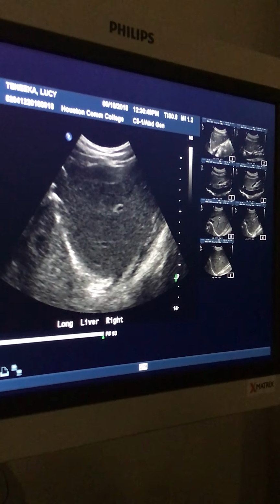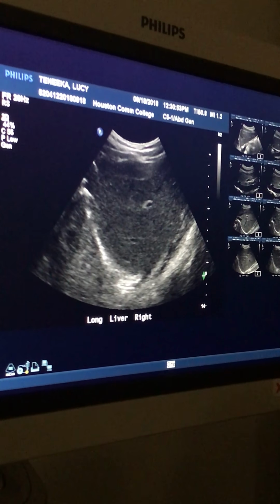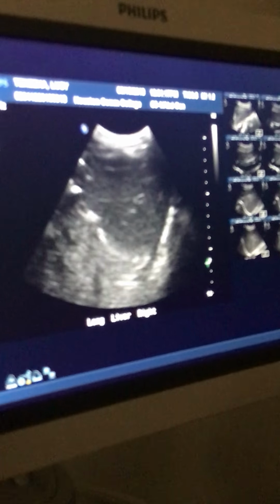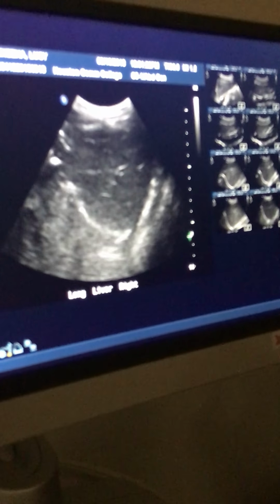So I'm going to take this for the next picture. Now, if you notice, I kind of just stopped here. You don't just stop there and move on. You go all the way through. So take a deep breath and hold it. So back to left portal vein, right portal vein. That's even better. Bifurcation picture, and then all the way up to the dome. But I'm going to keep going until I see nothing because I want to make sure there's no mass. There have been tons of times I found masses up here. So you want to make sure you go all the way through, and then you can come back down, and that's another good dome picture here.